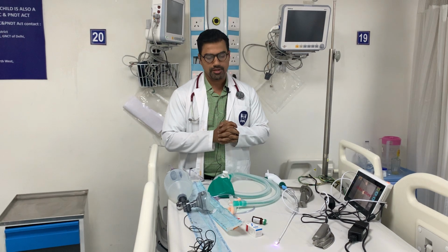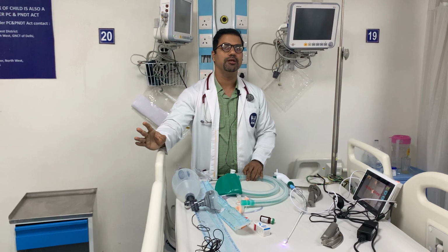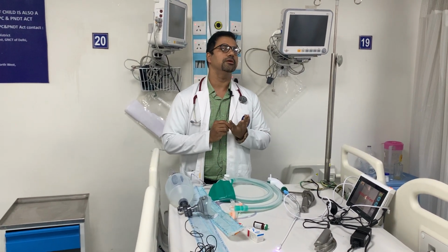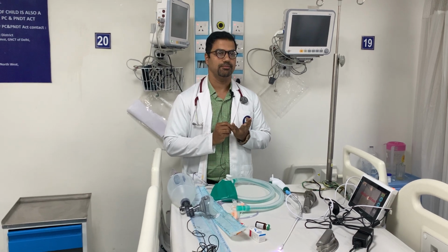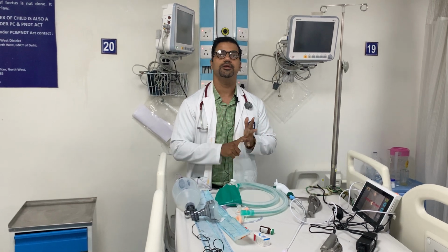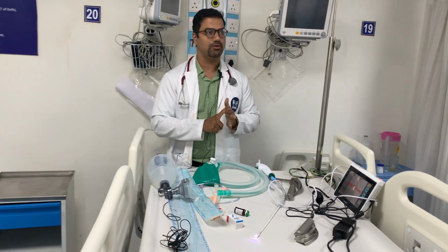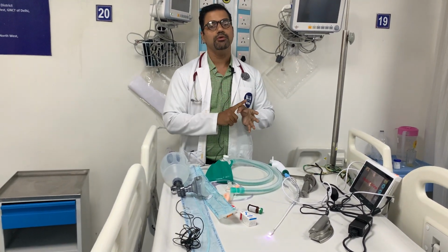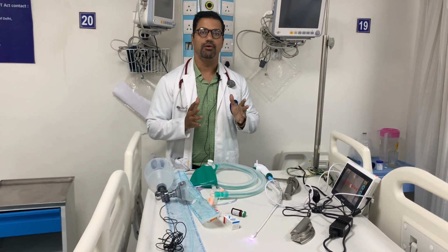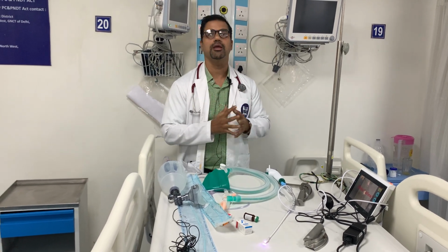As per the society guidelines, whenever you intubate a patient, you have to consider a couple of things. First, the patient should not have a dreadful experience, okay? Because when you are intubating, it's not like the patient is dead; the patient is alive, the patient is aware. Many a time we go for awake fiber optic intubation, which we'll be discussing here. So the patient is awake and you can't just treat him like cattle. The hospital industry is just like the hospitality industry. We need to take care of that.